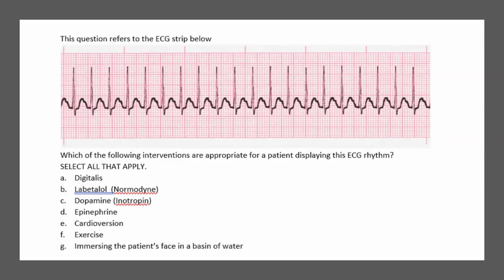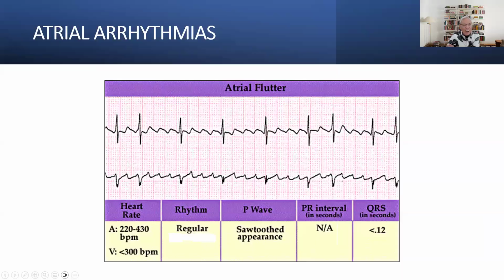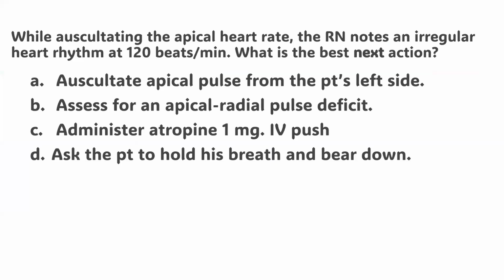200. Yeah, 200. I counted 20. Is it 20? How about the others? 1, 2, 3, 4, 5, 6, 7, 8, 9, 10, 11, 12, 13, 14, 15, 16, 17, 18, 19, 20. Yeah, it's 200. Oh my God, that is going to be fast. It's definitely SVT.